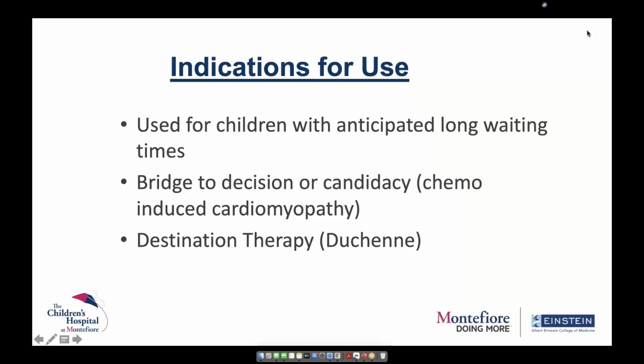We would use it in children with anticipation of long waiting times, because potentially you can go home on this device. It can be used as a bridge to decision or candidacy, so in patients who have chemotherapy-induced cardiomyopathy, to decide whether they're eligible for a transplant. It can be used in Duchenne muscular dystrophy patients as destination therapy.